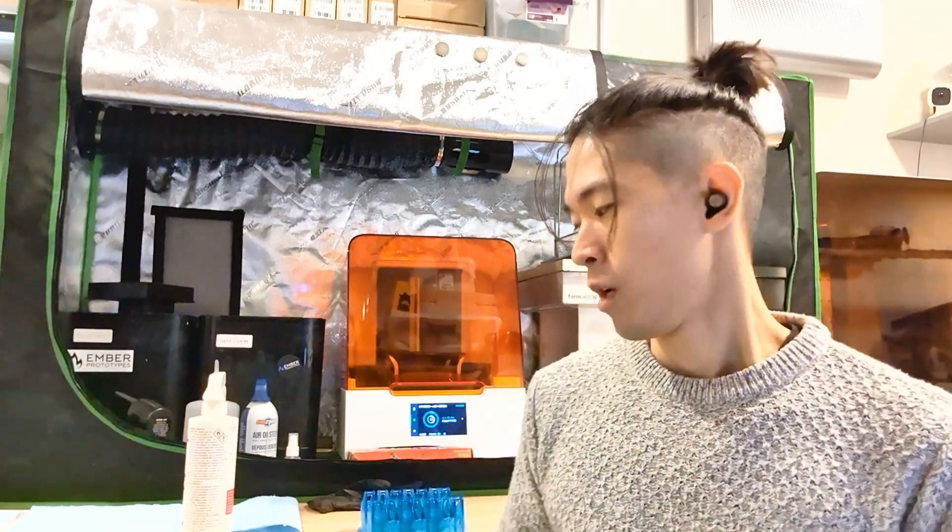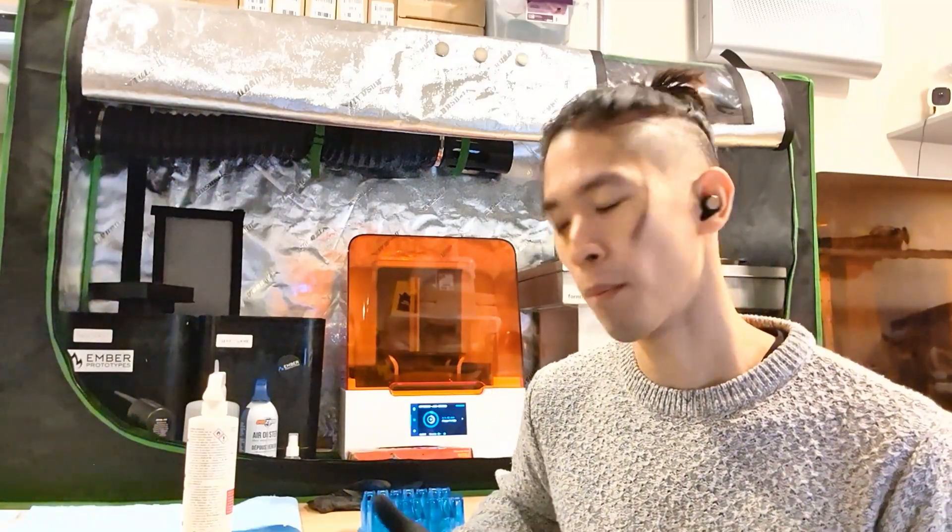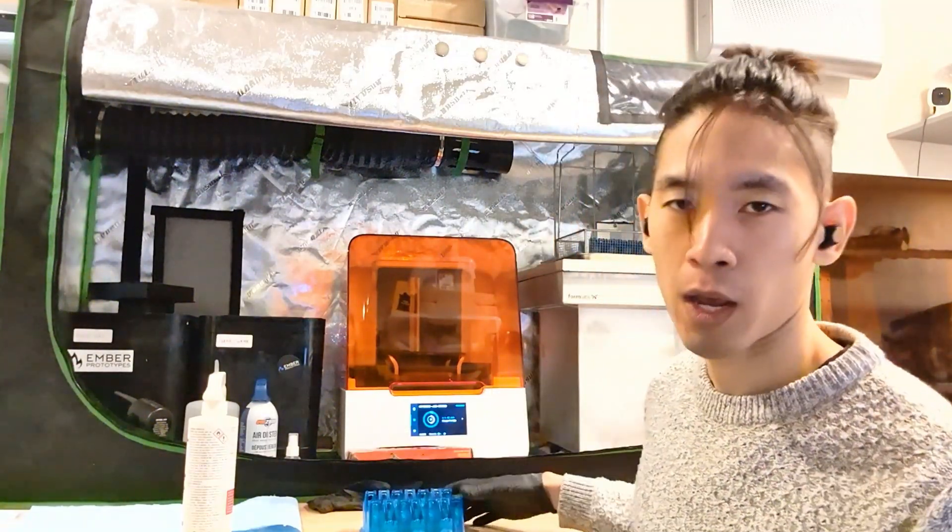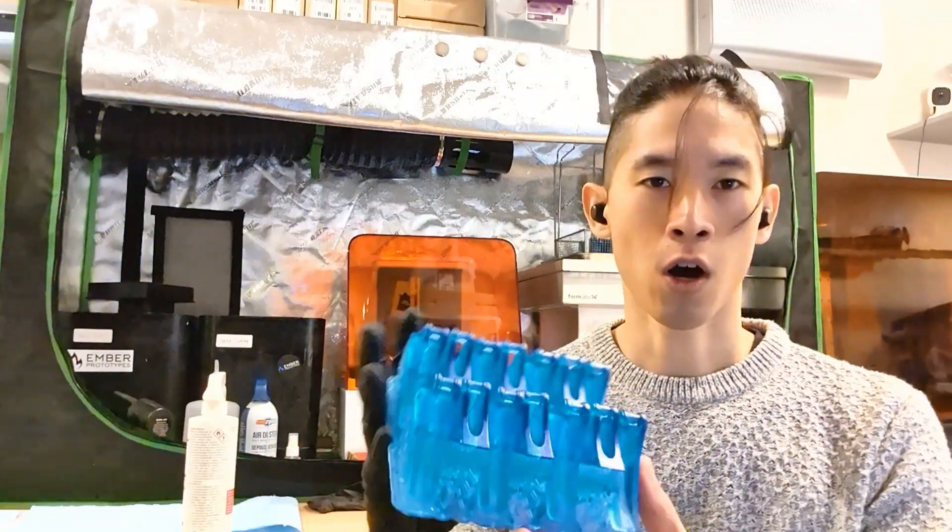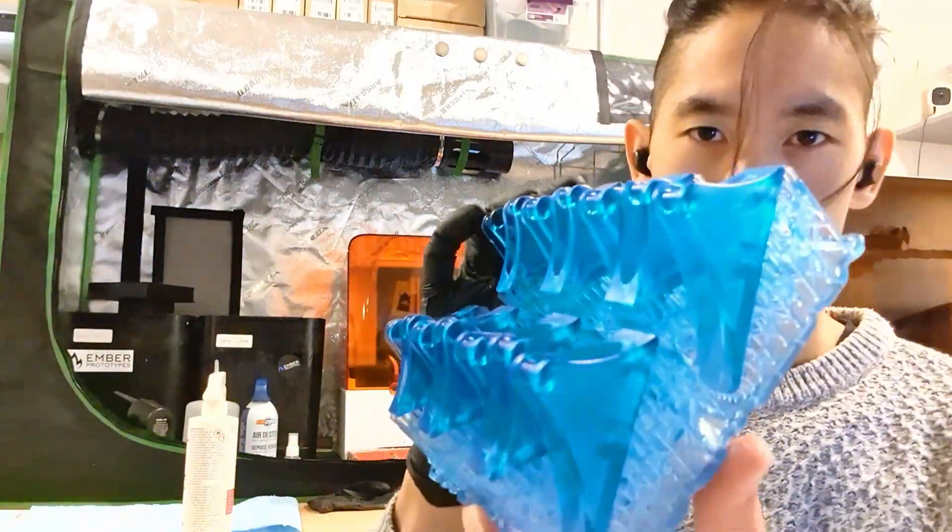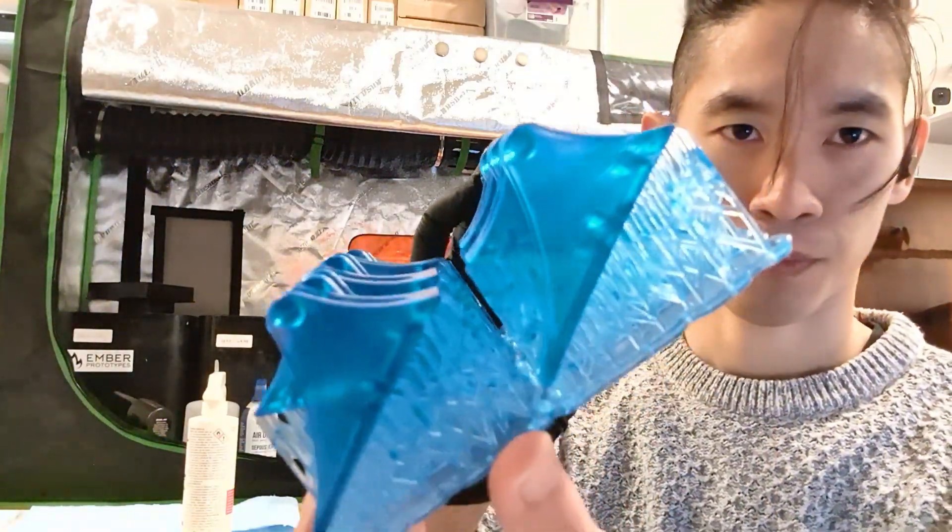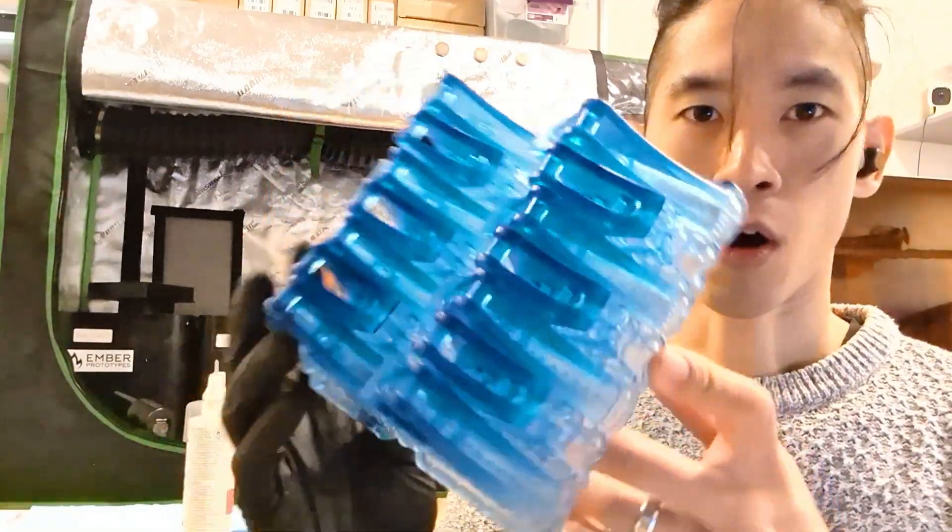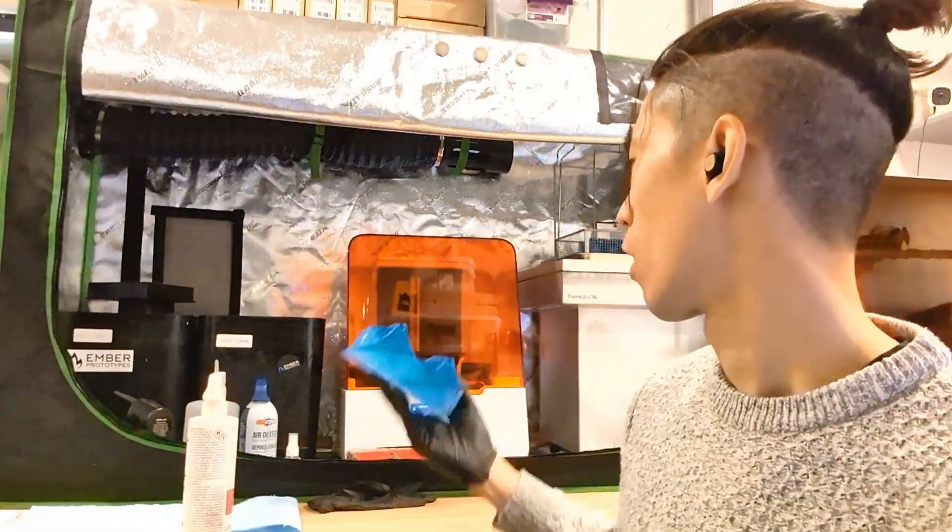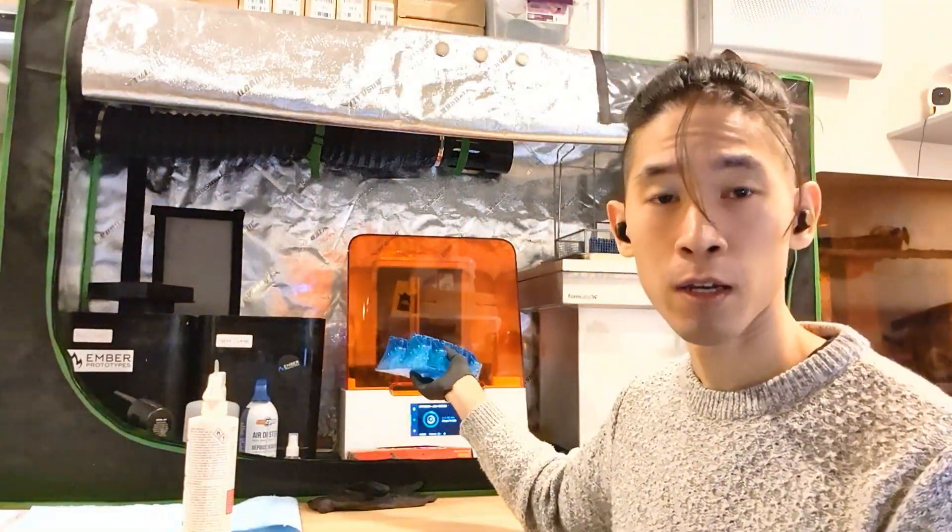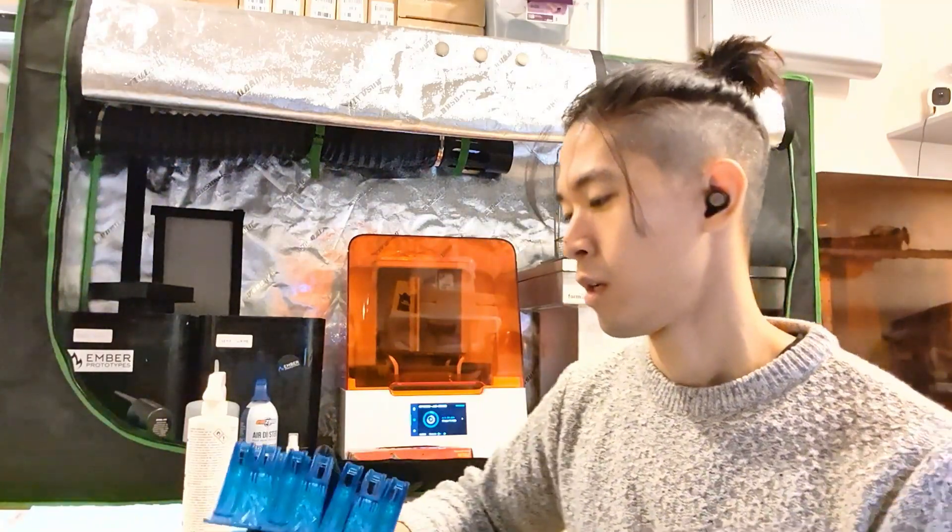Hey everyone, Phil from M-Prototypes here. So we've been doing a really big bio-med project for a local company here in Vancouver. And we've been printing a lot of these little adapters on our Form 3B, which is this guy right here.